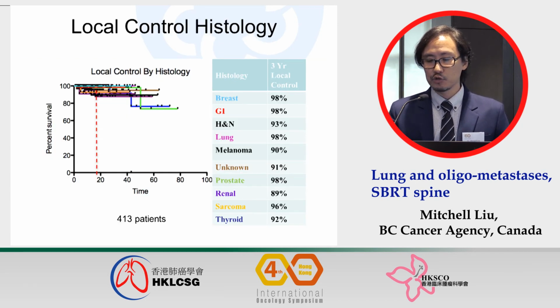Spine SBRT treatment has been shown to give good local control in different pathologies, including radio-resistant disease, for example, melanoma, renal cell carcinoma, sarcoma.